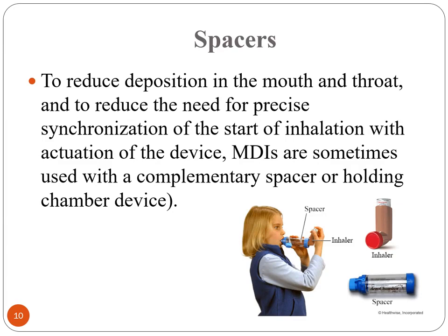Inshallah, by the end of the lecture, I will provide you with videos that indicate the proper use of these spacers, inhalers, and different types of inhalers.